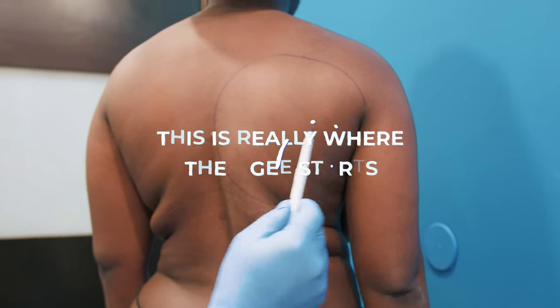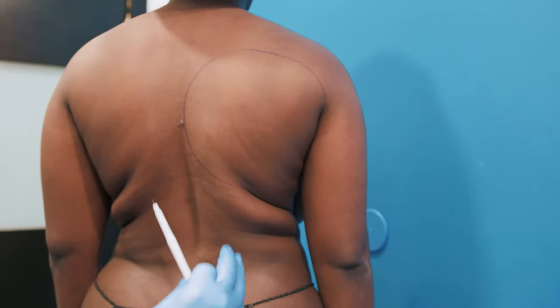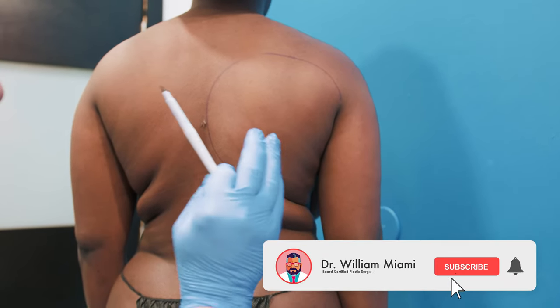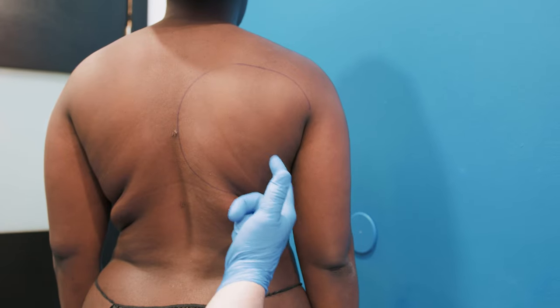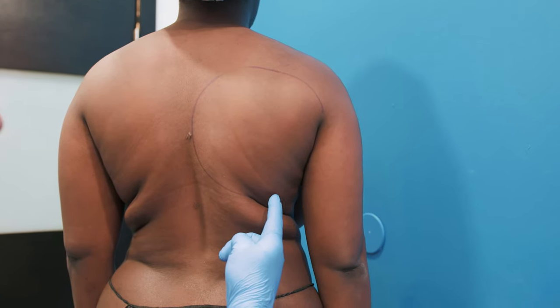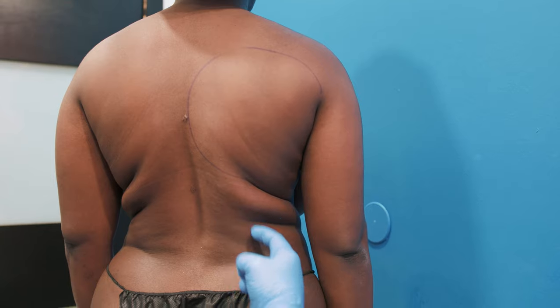This is really where the OG starts — high in the back. Whether I'm doing a BBL or whether I'm doing lipo, it's the same exact OG lipo, and it always starts high in the back. She didn't really get this area lipoed, and you have to have this area done because this is the concave part of the OG.